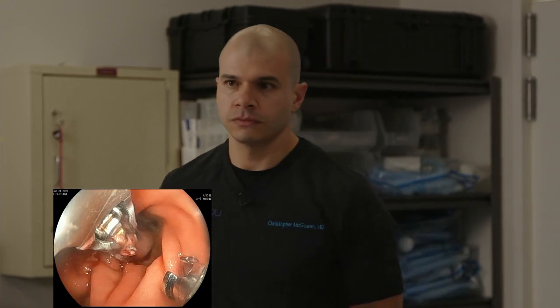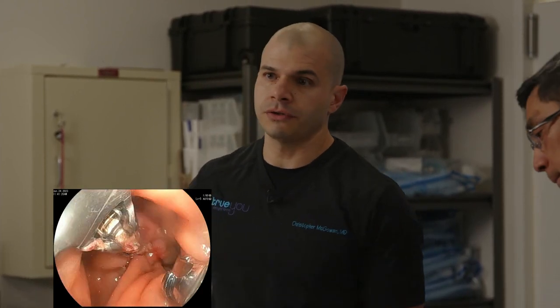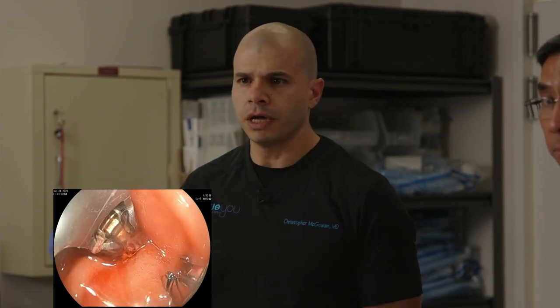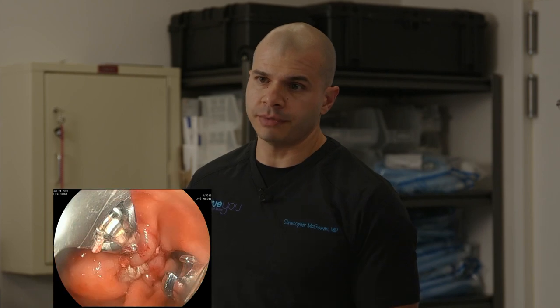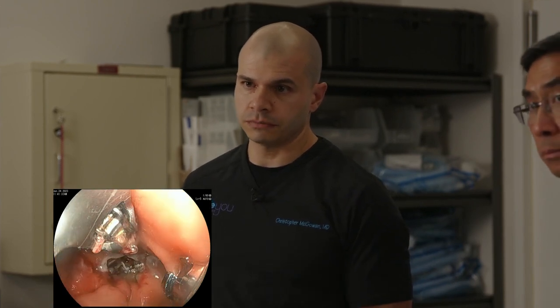Anne from Facebook wants to know, if you decide to do the procedure in the hospital, is it because of a higher risk versus doing it in your office? So the vast majority of our procedures are performed here in an ambulatory surgery center. We do perform some in a hospital environment, generally just our patients with higher BMIs or other comorbidities, where we want just a higher level of monitoring and support during the procedure. It's still performed as a same-day procedure, and so everything else is identical.